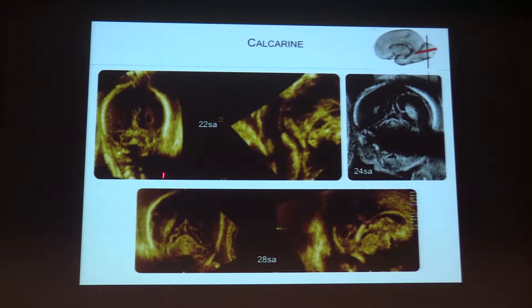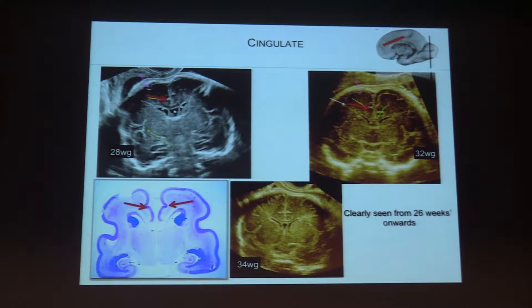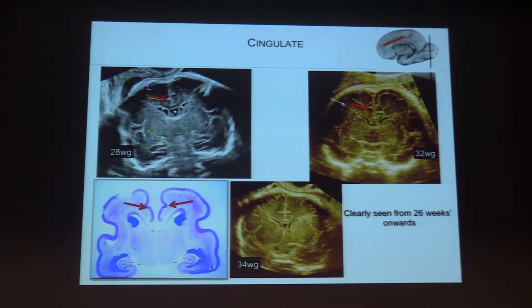After that, you have the calcarine fissure, which is better seen in the coronal plane to be orthogonal to it — here you can see the calcarine fissure on the coronal plane. The cingulate fissure, which is sagittal in orientation, will be easier to recognize on the coronal plane. It is very important to include on your report to confirm correct gestation between 20 and 26 weeks.